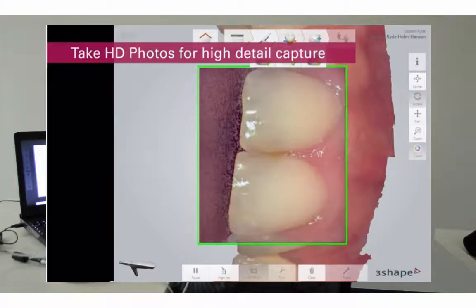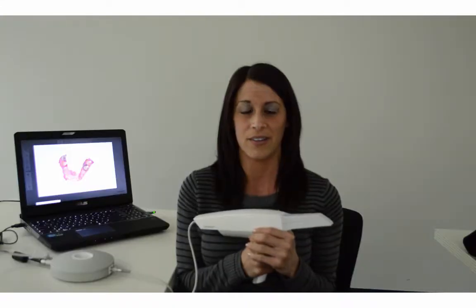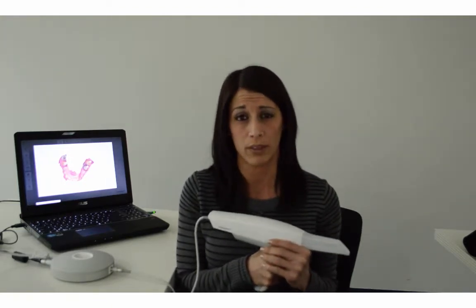It's also the only true color system on the market, which aids in our new exciting shade matching tool feature for custom shading. ThreeShape owns 80% of the marketplace in the lab world. This helps with flawless and seamless integration with your labs.